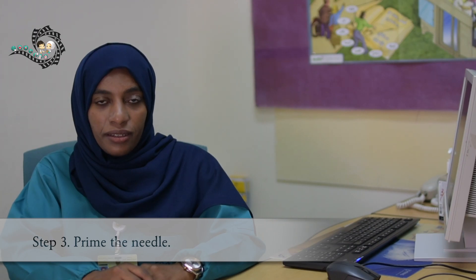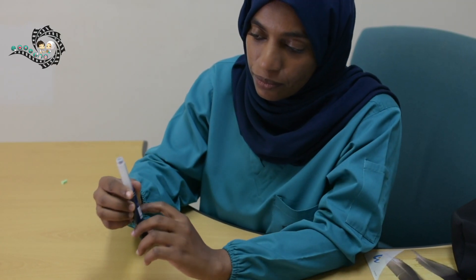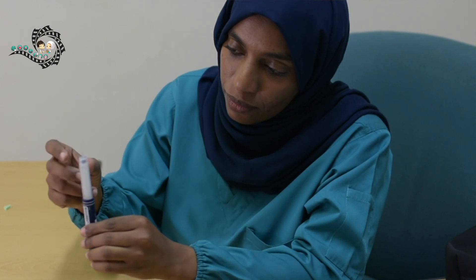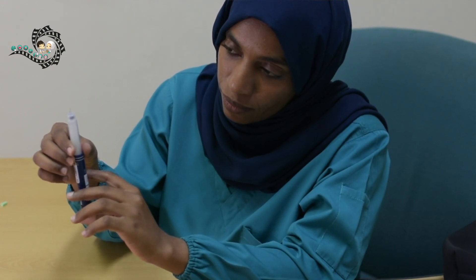Step 3: Prime the needle. To do this, turn the injection button to dial 2 units. Turn the pen with the needle facing upward. Tap the pen window to have any air bubbles move to the top of the pen. While keeping the pen with the needle facing upward, push the injection button all the way in. You should see the insulin coming out.